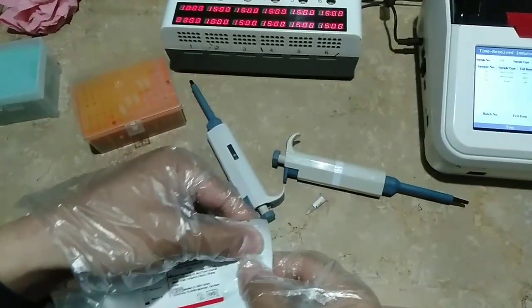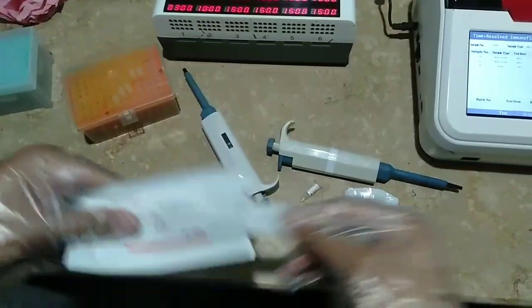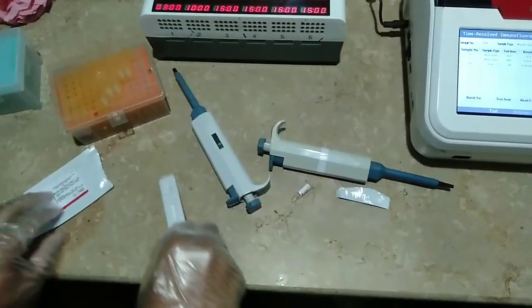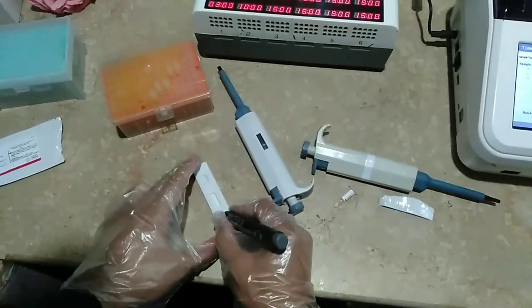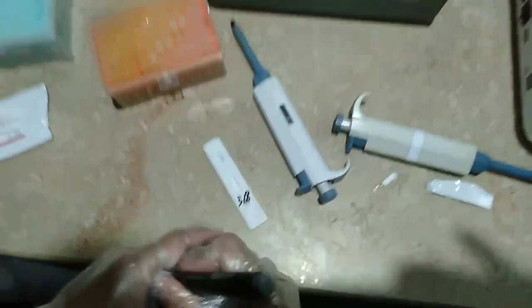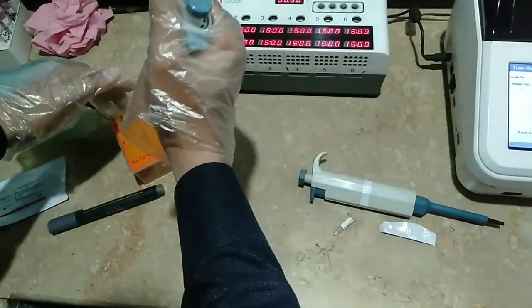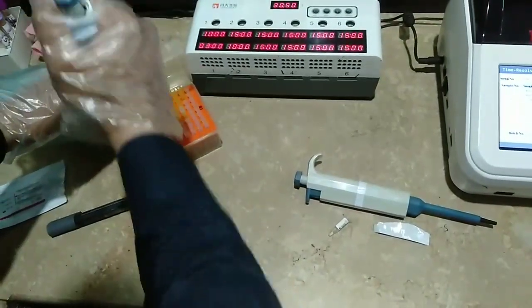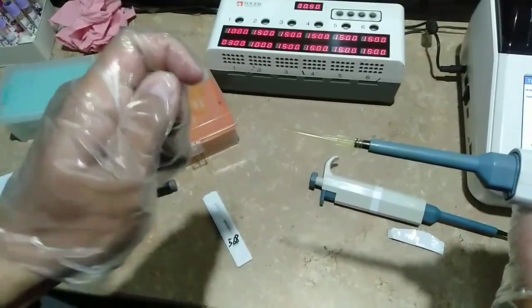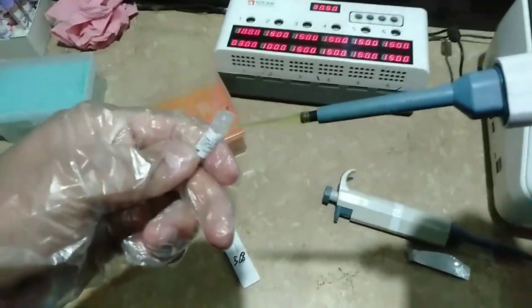Now after that, we will take out the strip from its wrapper. This is the cassette — we can also call it a strip — so this is a troponin strip or cassette. Now we will label it with the patient ID. This is the patient ID. Then we will take 80 microlitre — remember, 80 microlitre — from this buffer that contains our 20 microlitre of serum as we mixed it.